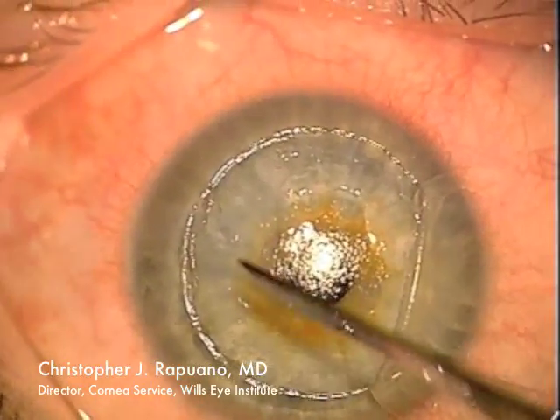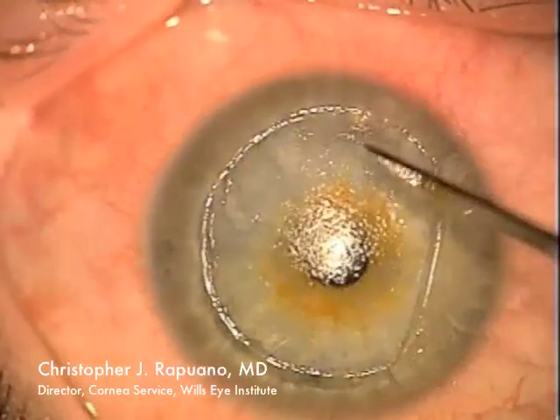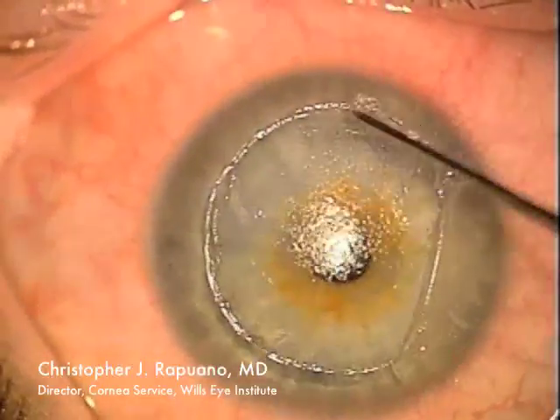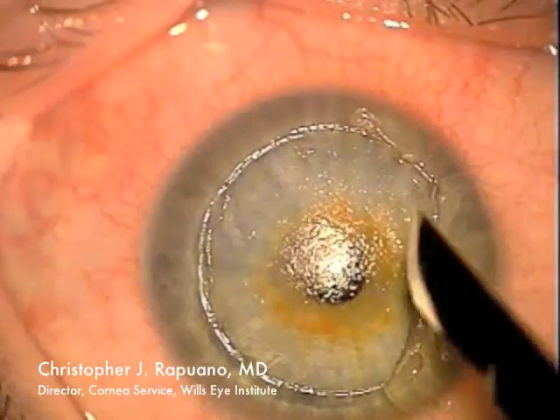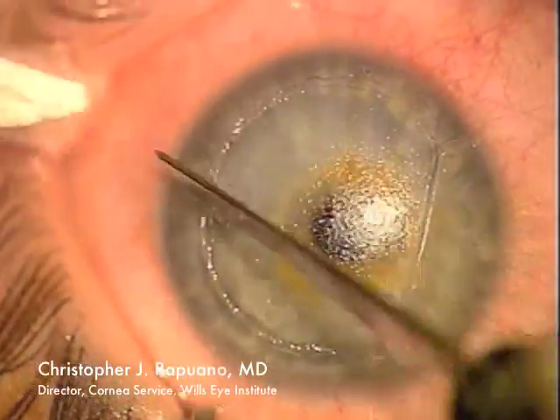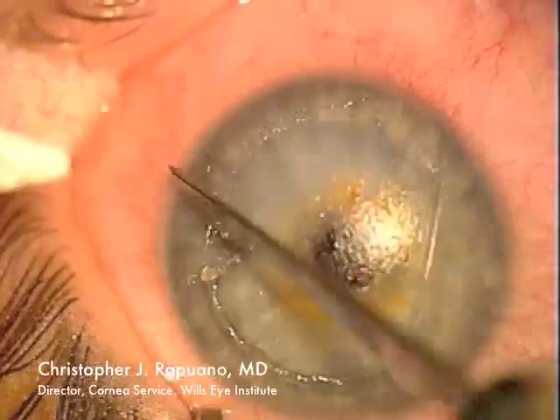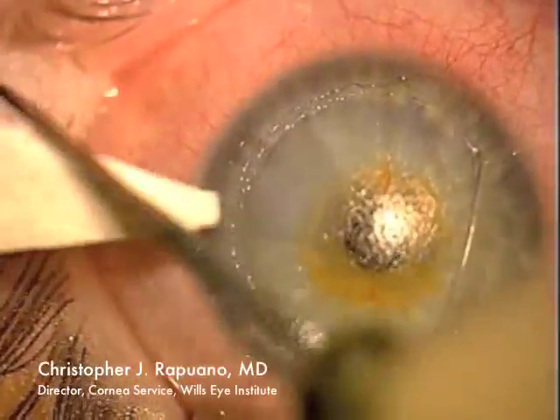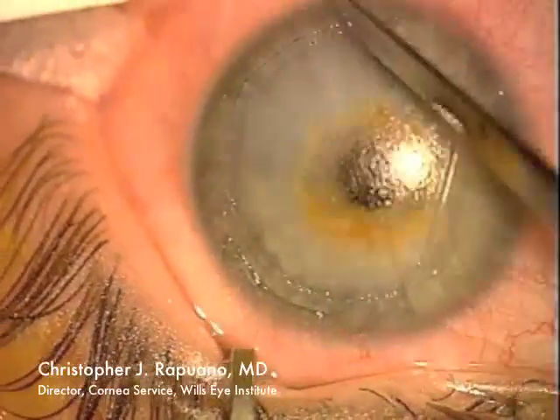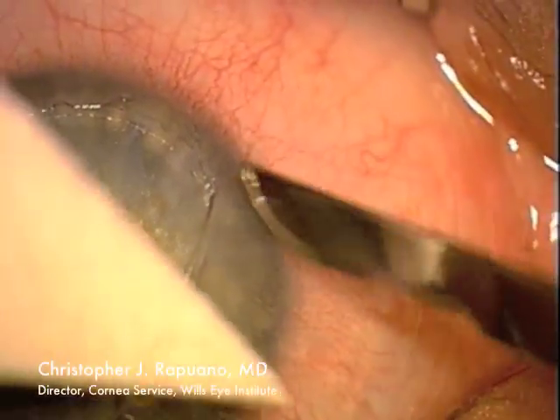Remember, there are also cells on the underside of the flap which I will need to take care of once I've taken care of the cells on the body of the cornea. I'm using a sharp blade to aggressively remove the cells from the stromal side of the cornea. I also remove the intact epithelium from the peripheral edge of the flap going a little bit past the flap edge. This allows the flap to adhere better with less chance of recurrent epithelial ingrowth. I'm very aggressive to try and remove all the cells from the stromal surface.